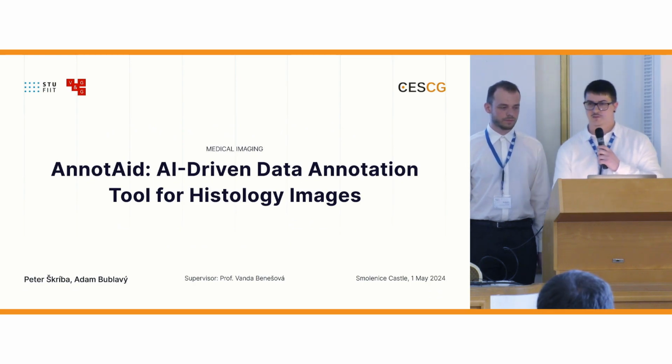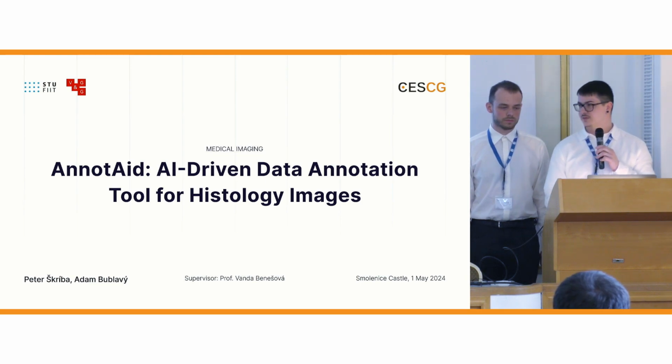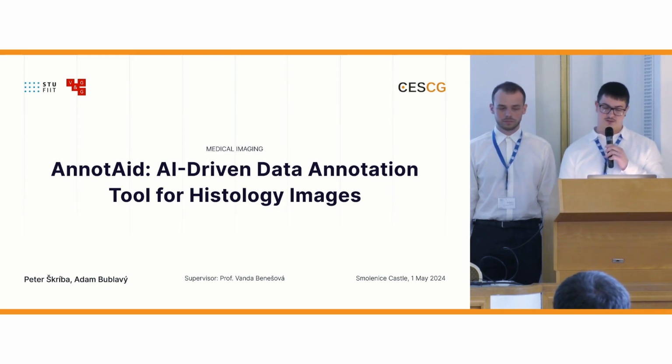Hello, my name is Peter from the Slovak University of Technology in Bratislava, and together with my colleague Adam, we made AnnotAid, an AI-driven data annotation tool for histology images.